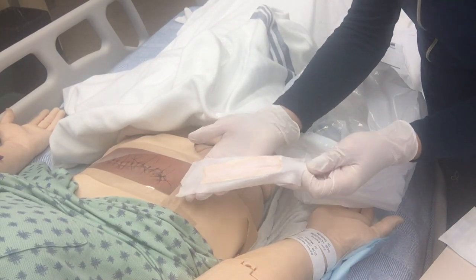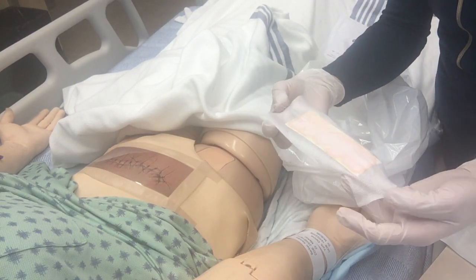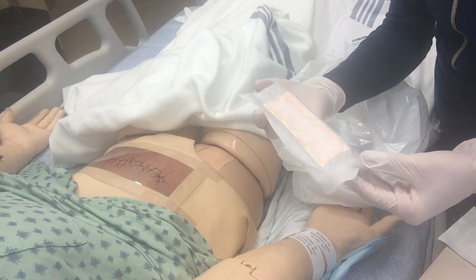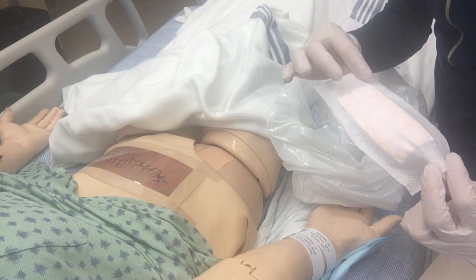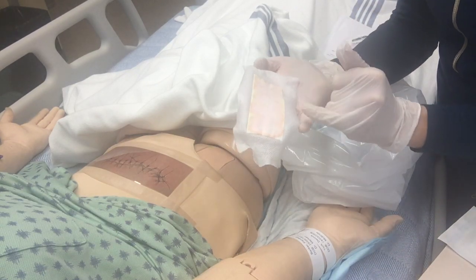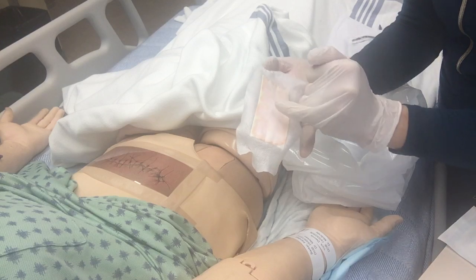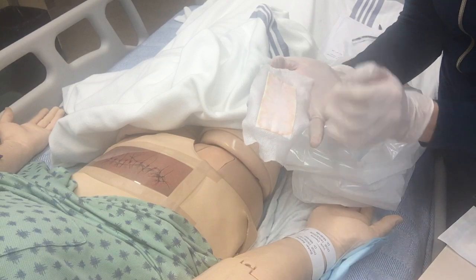And as I pull this old one off, I'm noting the amount of exudate on there. So is it saturated? I would say it's saturated, it's coming through. You can see, I'm going to note the type of exudate, so it looks a little bit pinkish, so probably serosanguineous, a little bit of yellow around the side, so it might be a little purulent.